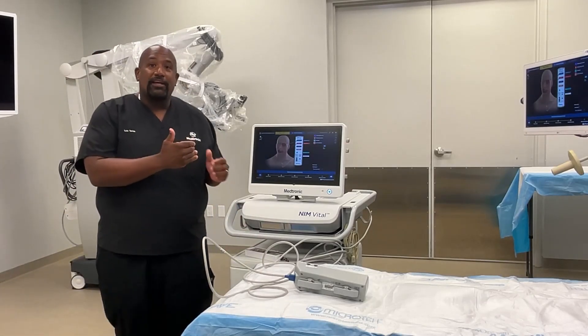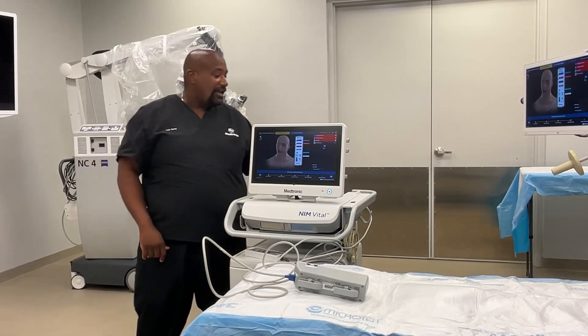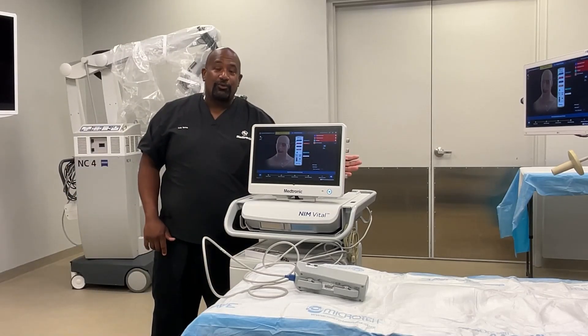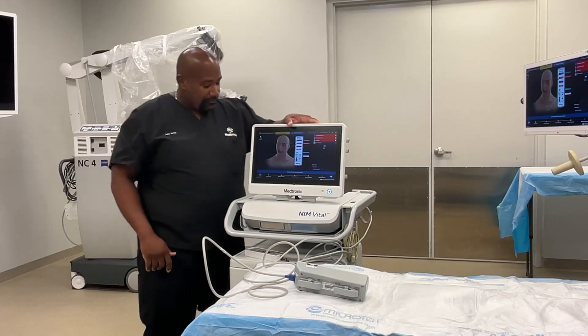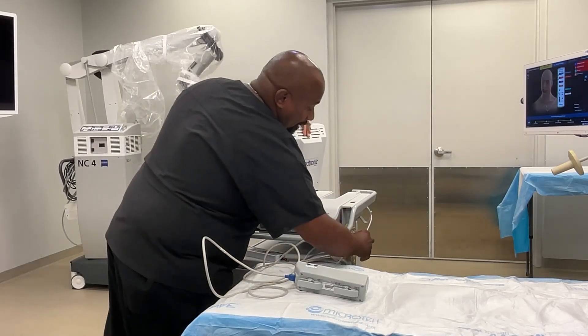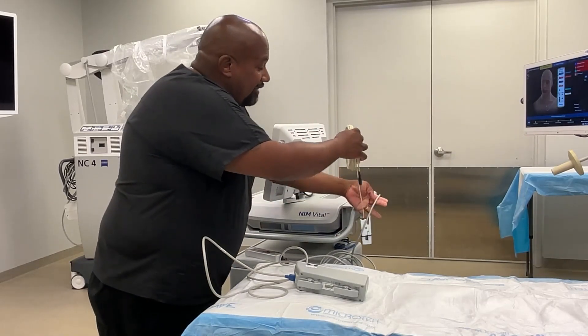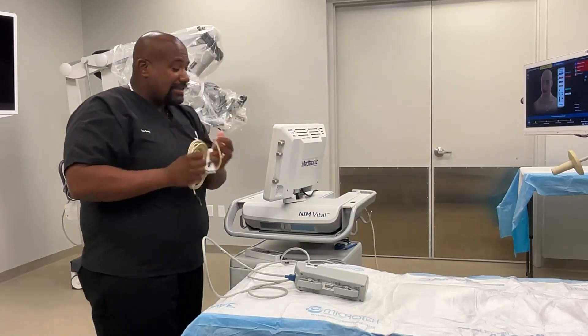If for some reason you're having an issue with the NIM not muting properly when using electrocautery, there is an adapter that you would connect to the back side of the NIM. It has a little port on the side, and you have your muting cord that you would plug in. That adapter gets plugged in and then your muting cord gets plugged into that adapter.